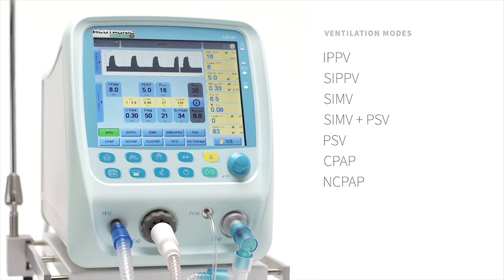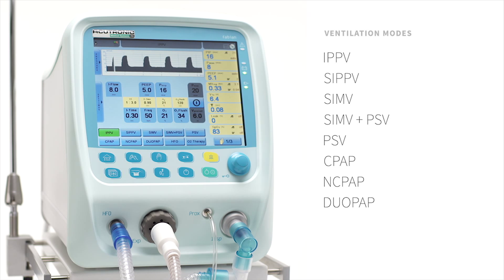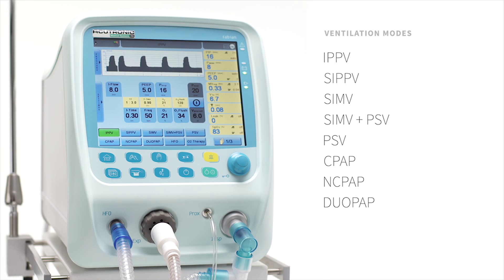NCPAP — NCPAP with variable flow generators like InfantFlow or MediJet. DUOPAP — NCPAP on two different levels, or if short inspiratory time is used, like a non-invasive ventilation with a fixed amount of breaths per minute. Only used for single limb systems such as InfantFlow and MediJet.